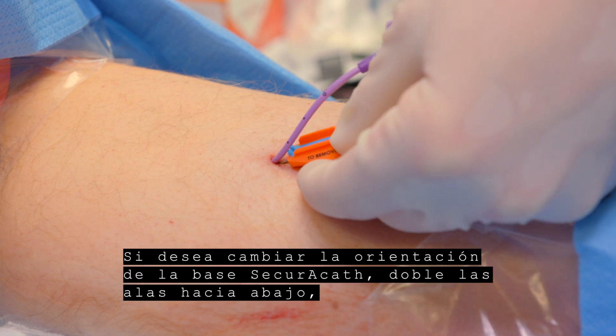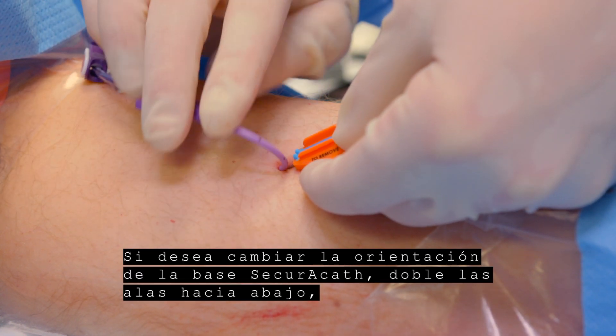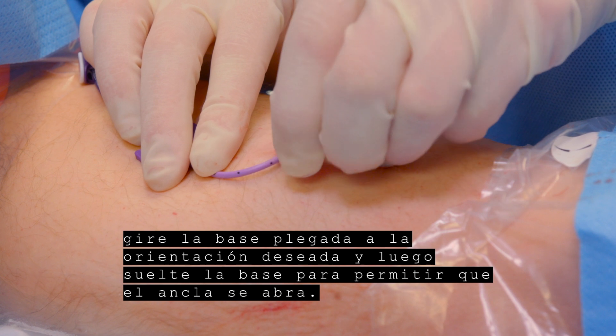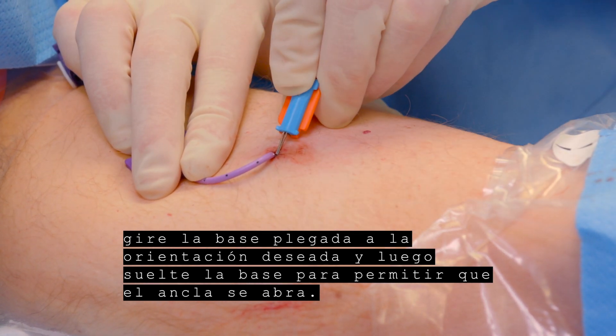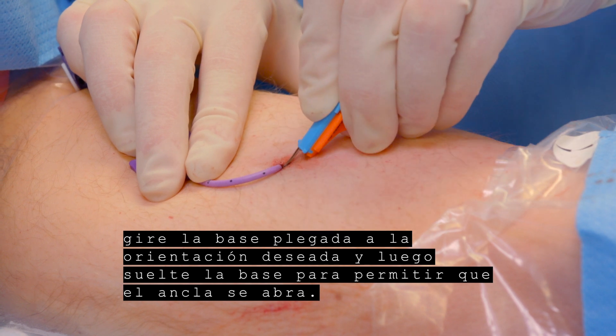If you wish to change the orientation of the SecuraCath base, fold the wings downward, turn the folded base to the desired orientation, then release the base to allow the feet to open.